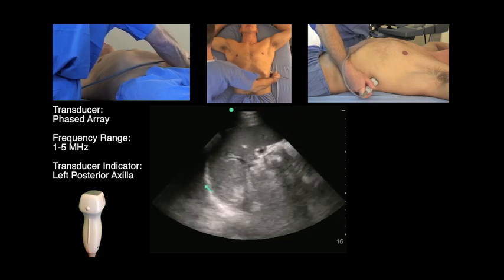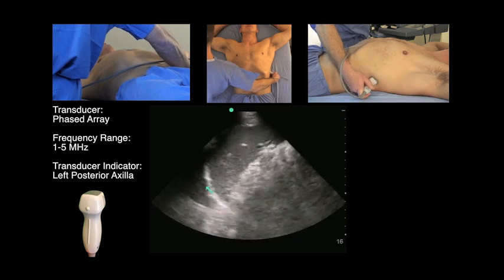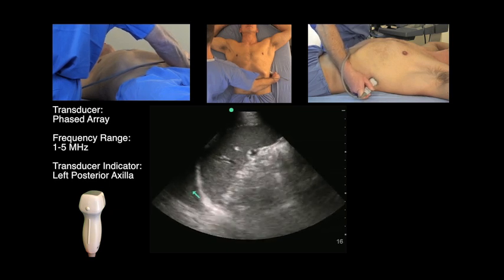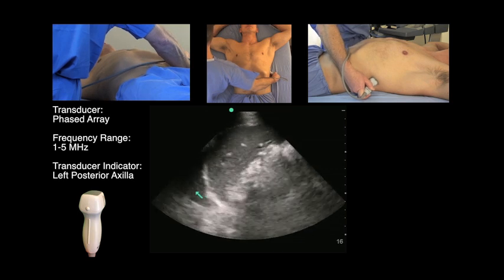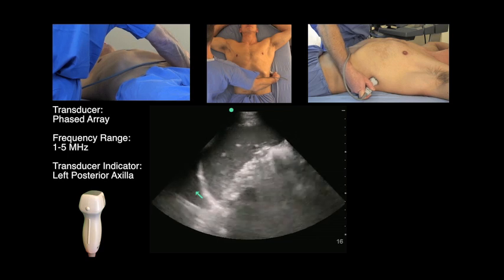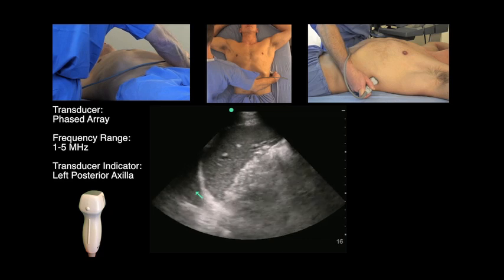The other thing we're looking for in this view is we're looking at the diaphragm on the left side here, and we're trying to look above or to the left of the diaphragm for, again, that mirror artifact, which assures us that we don't have a pleural effusion or hemothorax on the left.